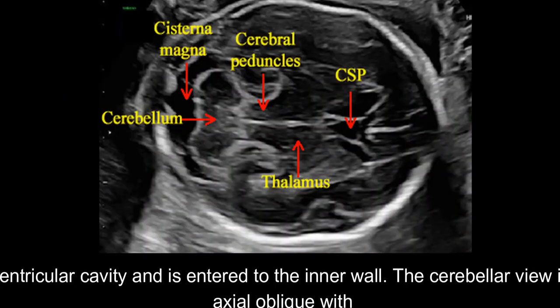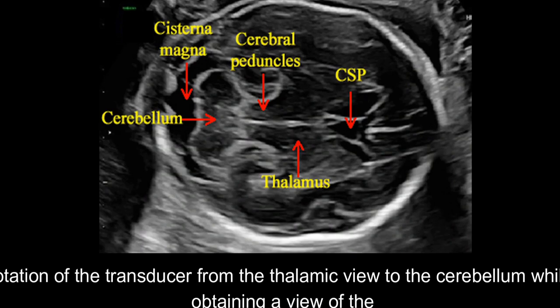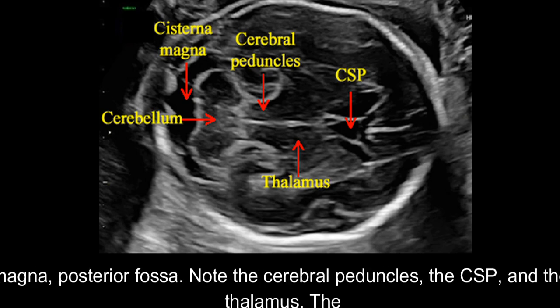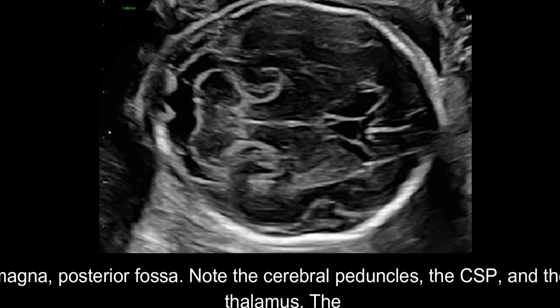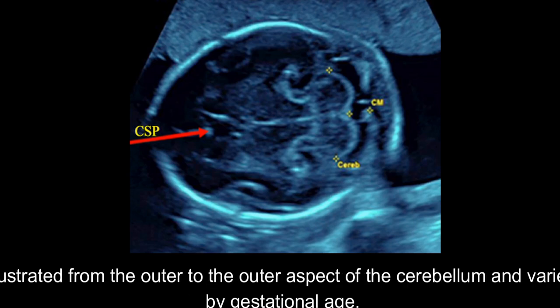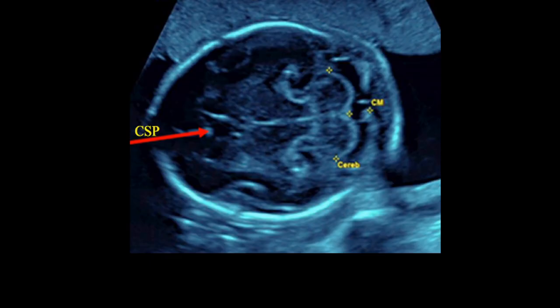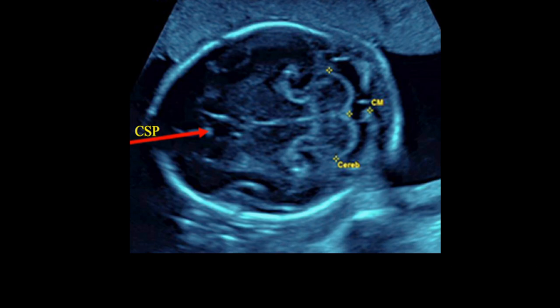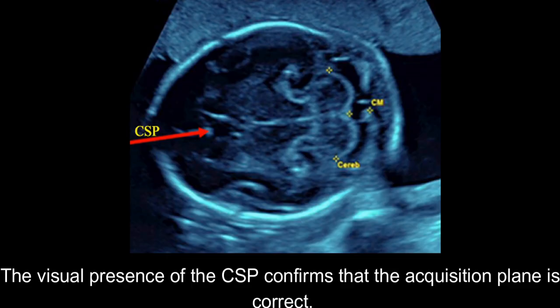The cerebellar view is axial oblique with rotation of the transducer from the thalamic view to the cerebellum while obtaining a view of the central cerebellar echogenic vermis. This plane allows visualization of the cerebellum and cisterna magna, posterior fossa. Note the cerebral peduncles, the CSP, and the thalamus. The transcerebellar diameter is measured from the outer to the outer aspect of the cerebellum and varies by gestational age. Note the box-like cavum septi pellucidae, CSP, which is seen with the cerebellar view. The visual presence of the CSP confirms that the acquisition plane is correct.